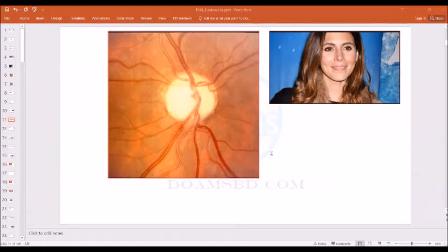Yes, I also see the surrounding retina. Now I am seeing all quadrants of this retina anti-clockwise. The other part of the retina is quite normal. There is nothing wrong. Okay. Now look at my torch. Looking to the light, the macula is visible, and the macula is normal.